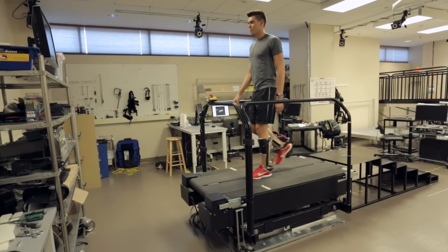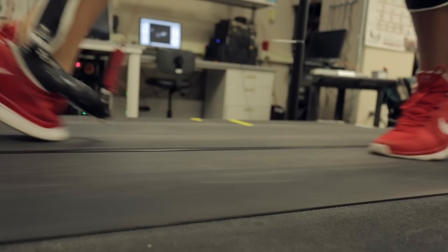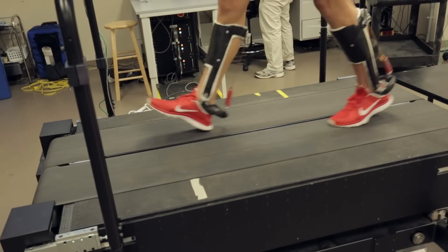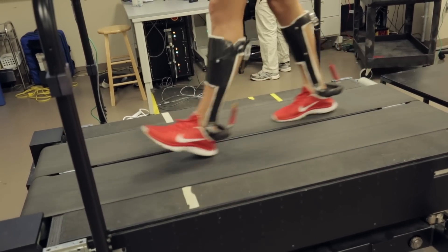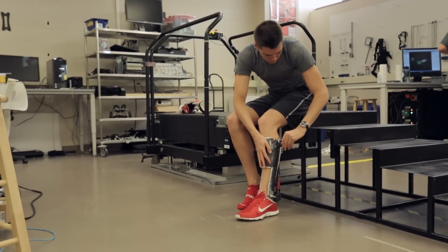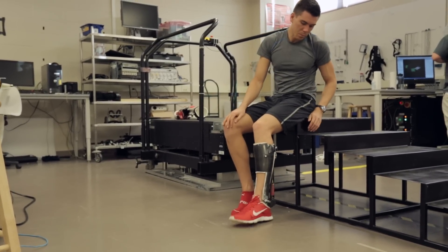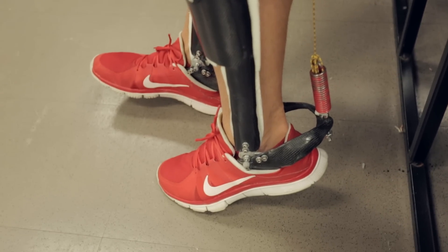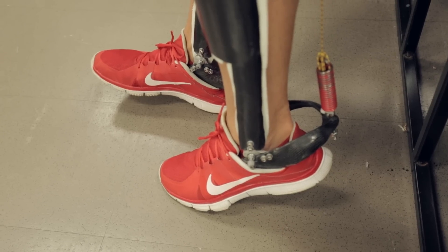What we learned in our lab over the last few years is that humans, when they use their calf and Achilles tendon, they're not using their muscles as motors — they're actually using their muscles as clutches. So we had the idea to take that clutch spring, or the Achilles tendon calf muscle, and copy-paste it outside the body in a mechanism that could be worn in a carbon fiber skeletal structure — an exoskeleton.